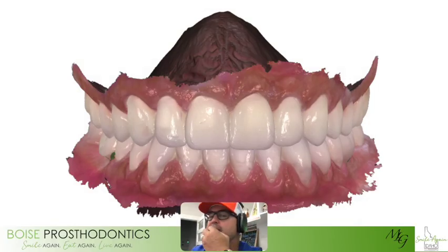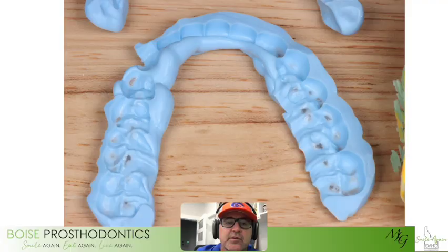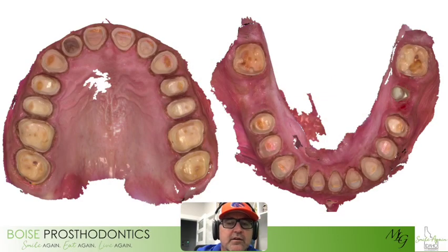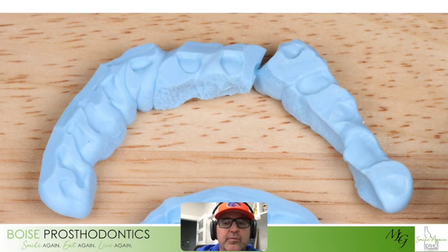So here's the records, just going through that. Here's his prototypes. Here's a pre-visit scan of his teeth with the Trios. Here's a pre-data gathering with a bite. Here is those teeth in that relationship with his bite. These particular images are after we packed cord and refined all the tooth surfaces to make them very smooth. And here is a bite record to help maintain that.